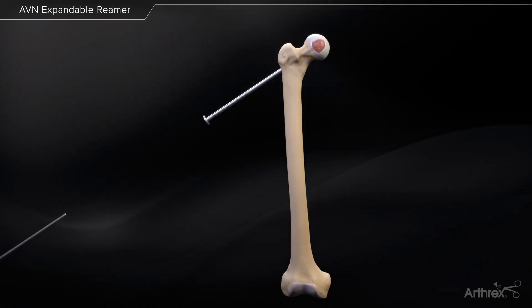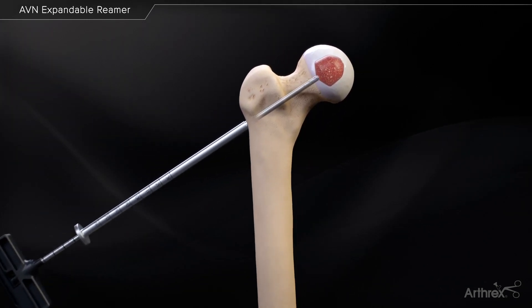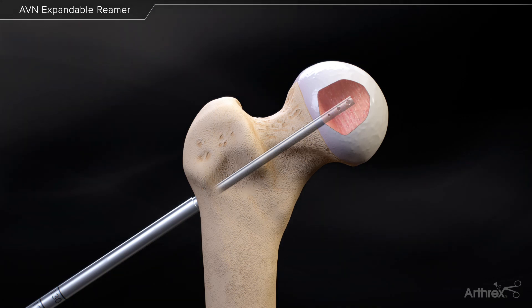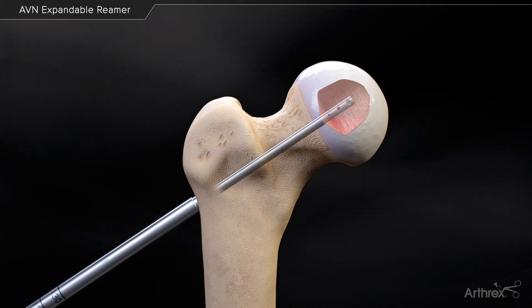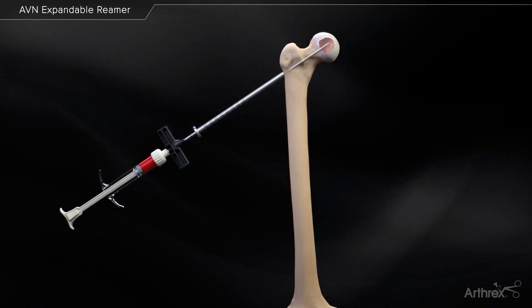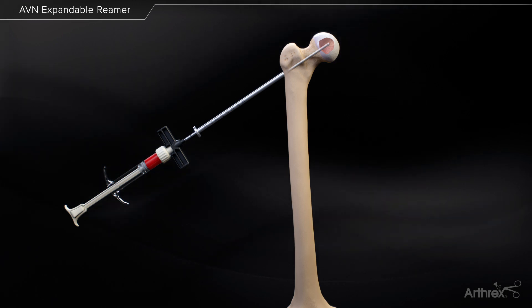Insert the Biologix delivery cannula into the prepared socket and remove the inner stylet. Flush out the defect with a combination of fluid and suction attached to the distal end. Attach a syringe filled with Arthrox DBM or autografted bone mixed with autologous fluid to the cannula.